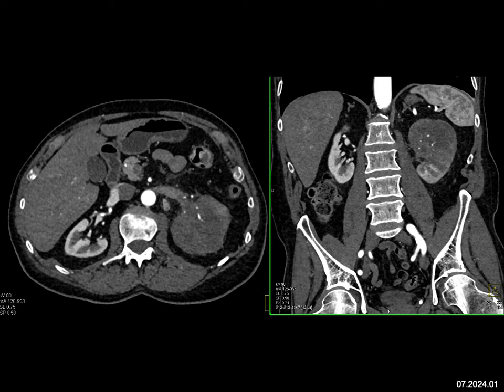There's a little bit of function in the lower pole of the left kidney. This could be lymphoma — lymphoma can be infiltrating, usually involving the entire kidney, but can involve portions. It can be single or multiple lesions, usually bilateral. This could be a renal cell carcinoma, an infiltrating type, maybe papillary rather than clear cell. More likely, and in fact what this is, is transitional cell carcinoma infiltrating the kidney. The area of the calyces are distorted — it's a large bulky transitional cell carcinoma with a small periaortic node.